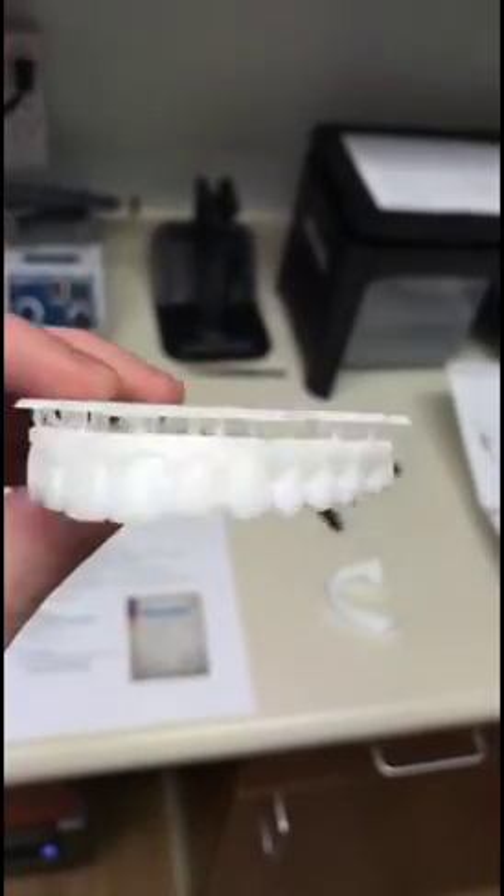Here's the final product. They look really good — just got to clean them up a little bit. Let's compare it to the real thing. Nice.